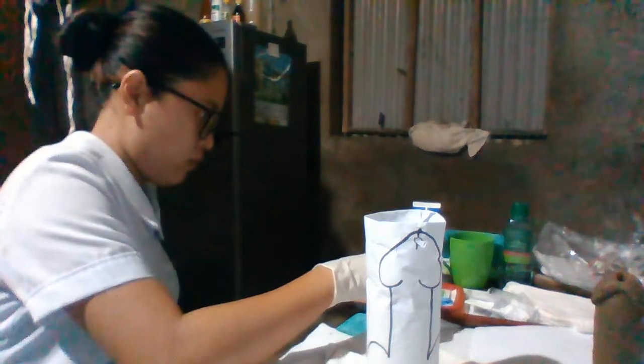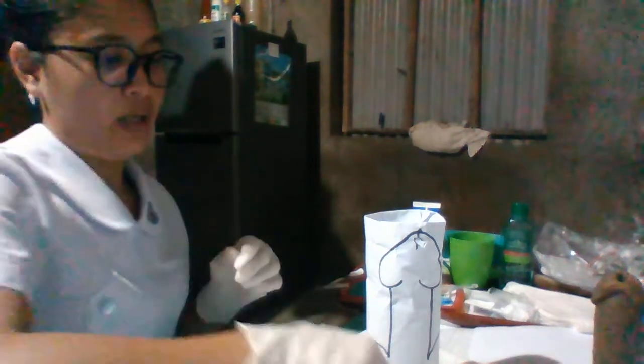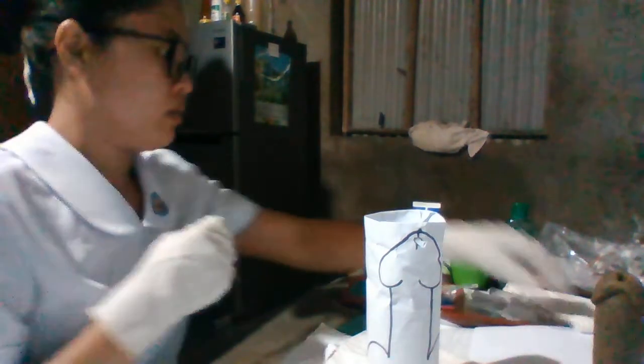Then we need to remove it using the fishing method so that we are safe. Then next, we need to drape the client, apply the sterile drape, and just expose the perineal area.